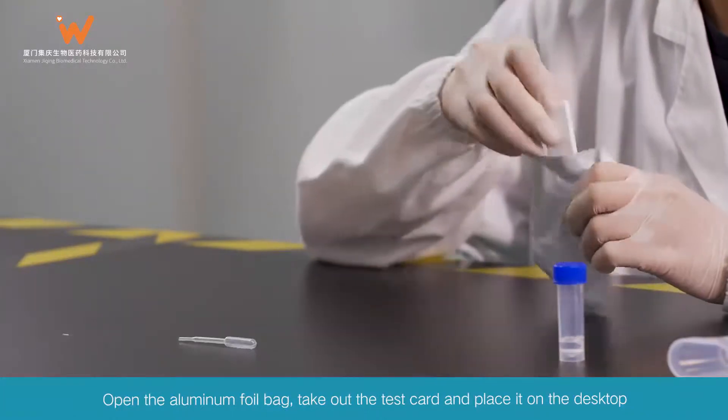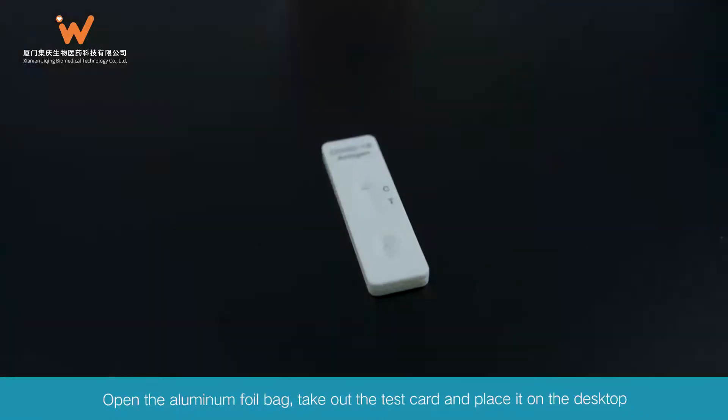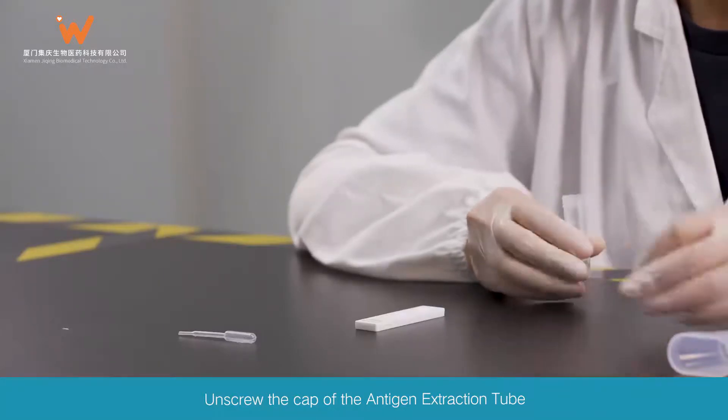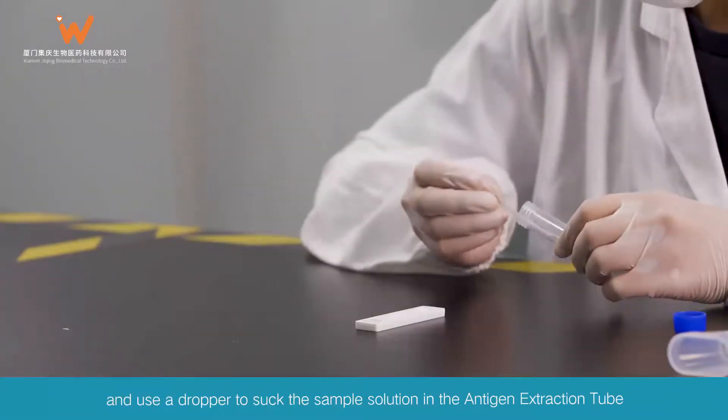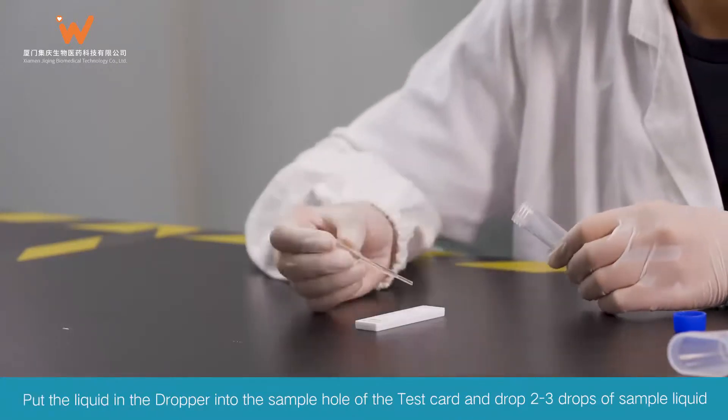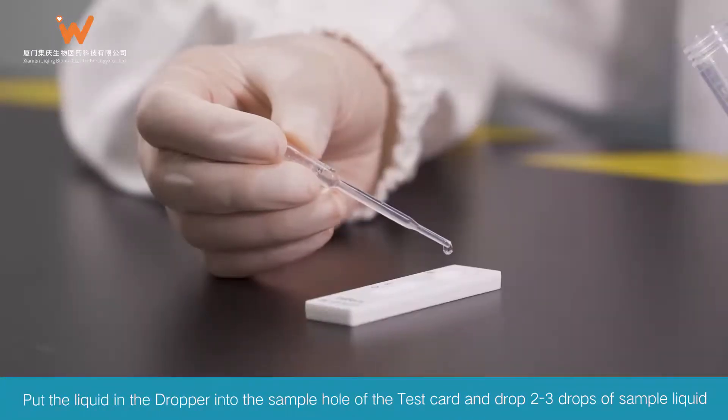Open the aluminum foil bag, take out the test card, and place it on the desktop. Unscrew the cap of the antigen extraction tube and use a dropper to suck the sample solution from the antigen extraction tube. Put the liquid in the dropper into the sample hole of the test card and drop 2 to 3 drops of sample liquid.